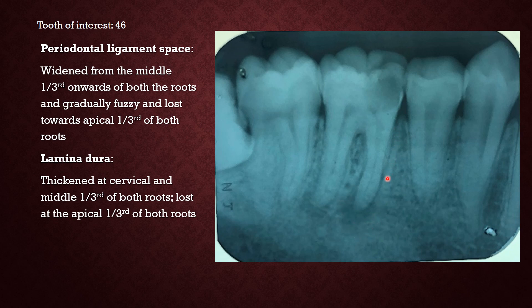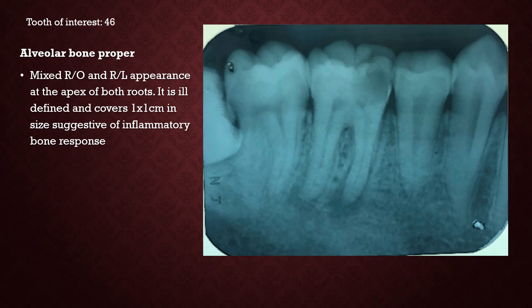The lamina dura can only be observed as thickened on the cervical and middle aspect of the root. The alveolar bone proper is the most important area of interest here. In this radiograph, you see a mixed radio-opaque and radiolucent appearance involving both roots. It is quite well-defined in terms of radiolucency but towards the periphery it becomes very fuzzy, mixed, and blending into a more radio-opaque appearance of the bone — suggestive of an inflammatory bone response. The entire size of the lesion is around 1 cm or a little more. The yellow arrow marks point to the more radiolucent part and the blue arrow marks point to the more radio-opaque part of the lesion.